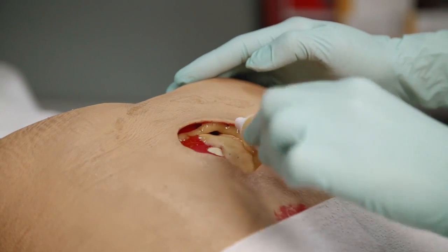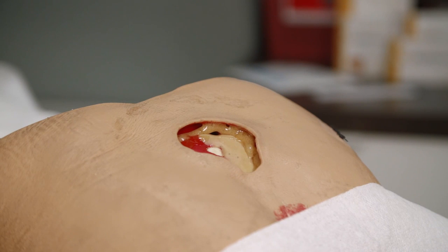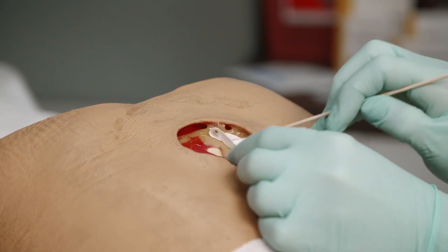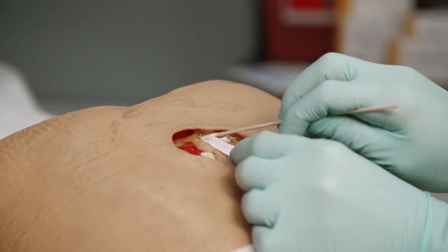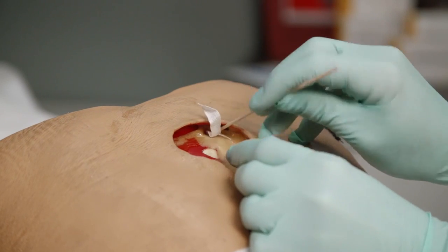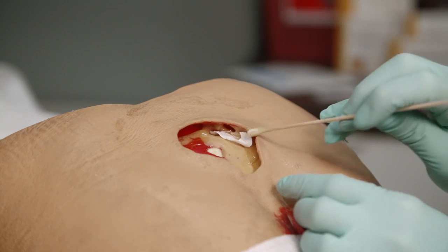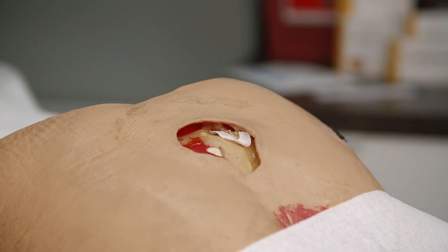This model is an example of a more serious wound where tunneling and undermining has occurred. In cases like this, it is important to make sure the Medihoney dressing has direct contact with the varying wound surfaces. Here, we use BioGuard packing strips to move Medihoney into the tunnel, ensuring contact with the undermined area.